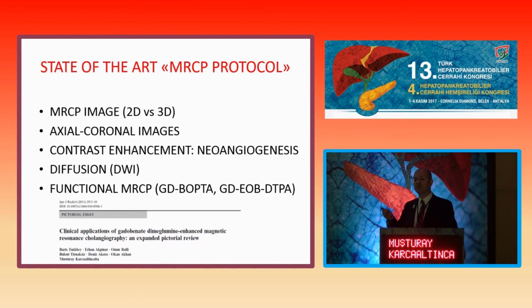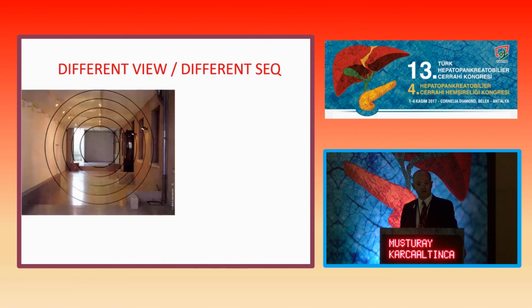And we always use hepatocyte-specific contrast agents. The importance of these contrast agents is that when you give the contrast agent, you can see the portal vein, hepatic artery, the venous system. In addition to that, we can see the biliary system, so it's excreted within the biliary system. Multihance is one of them, but currently it's not available in the country. But Primovist, although it's expensive, it's free in Turkey, so we can use it for all of our patients.